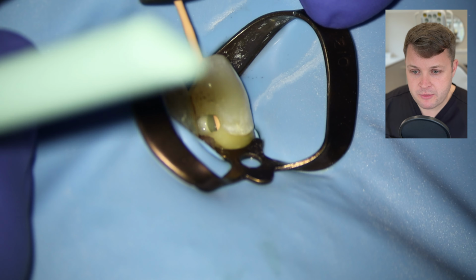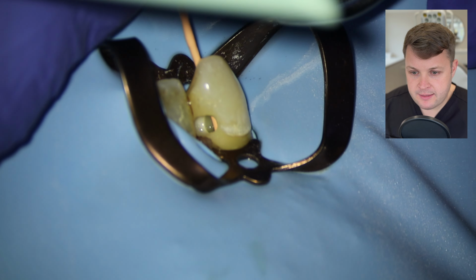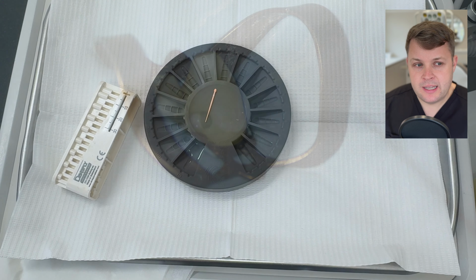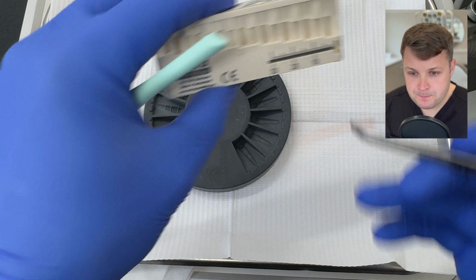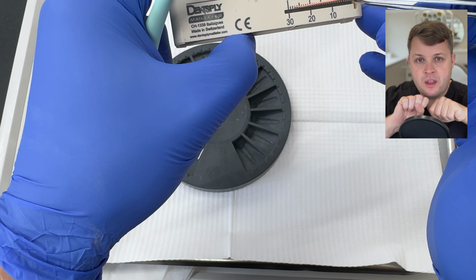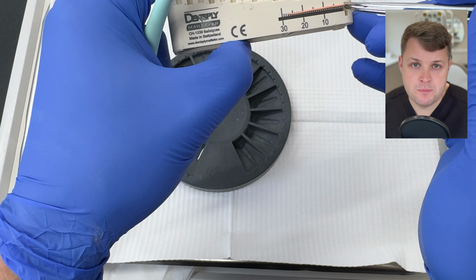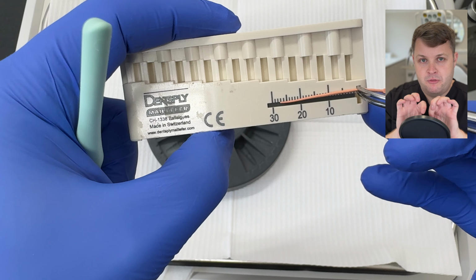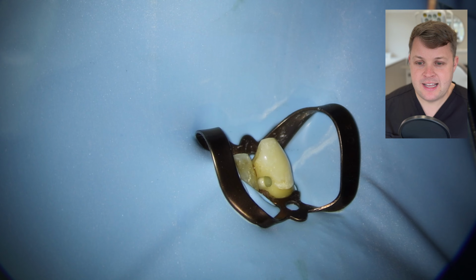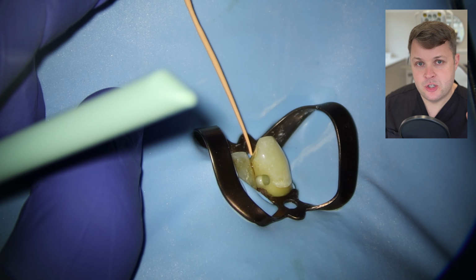In this case, I've done this off camera. We push it to length again. I notice here that we're a tiny bit short, so I give it another roll, keep rolling. What that's doing is making the GP cone thinner so it reaches to length. So the most important thing is not the filling further up the canal, because that's going to be filled with our bioceramic, but that the tip reaches the end of the tooth and fits snugly.